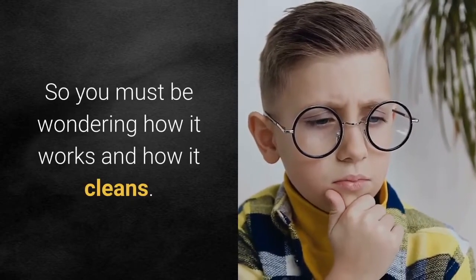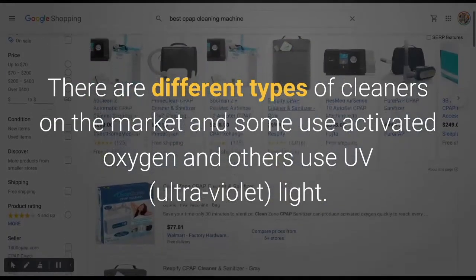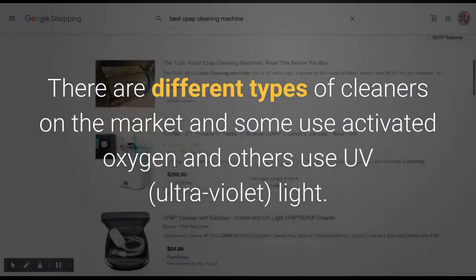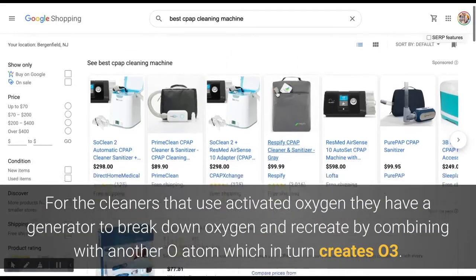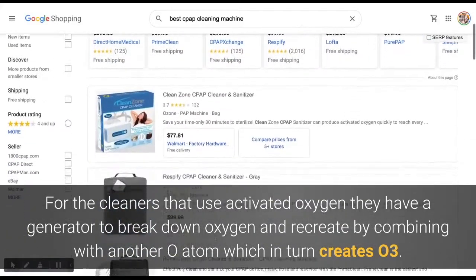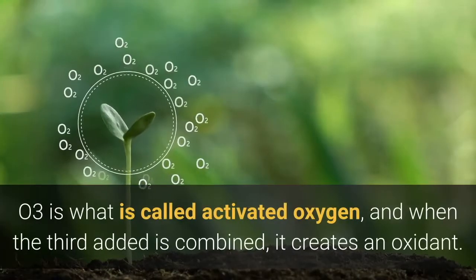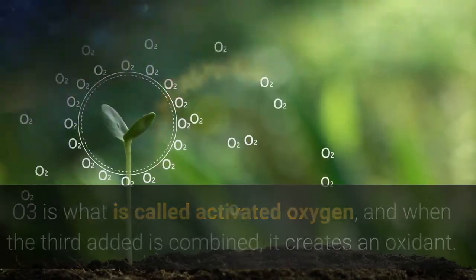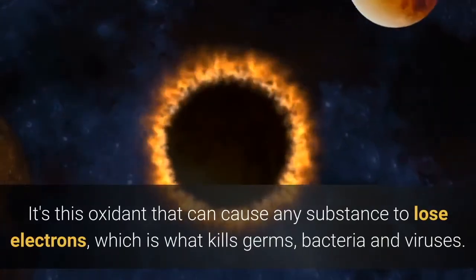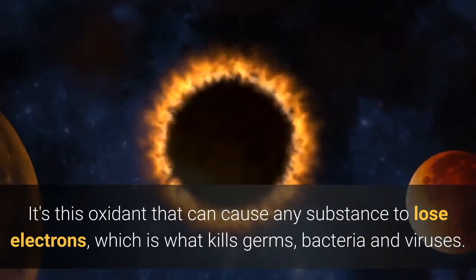There are different types of cleaners on the market — some use activated oxygen and others use UV, which stands for ultraviolet light. For cleaners that use activated oxygen, they have a generator to break down oxygen and recreate it by combining with another O atom, which creates O3. O3 is what is called activated oxygen, and when the third atom is combined it creates an oxidant. It's this oxidant that can cause any substance to lose electrons, which is what kills germs, bacteria, and viruses.